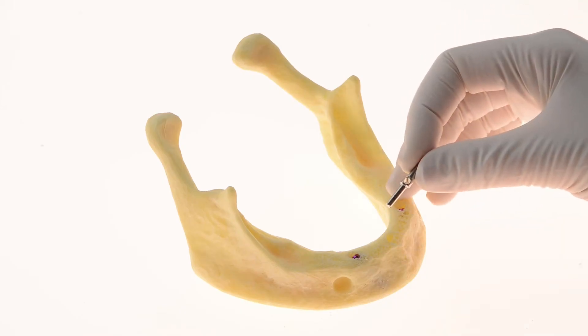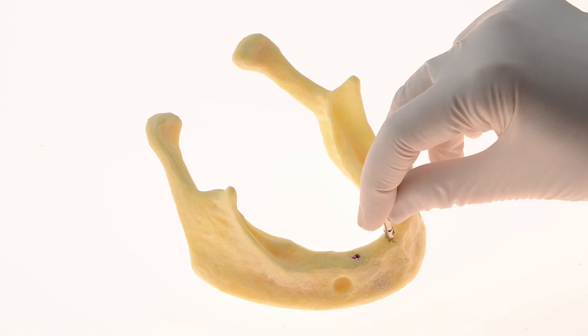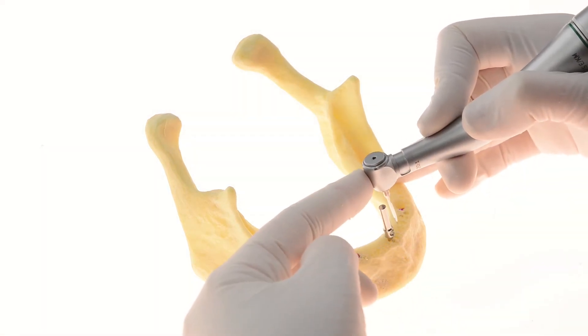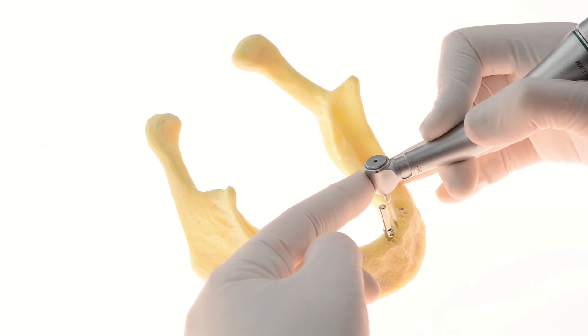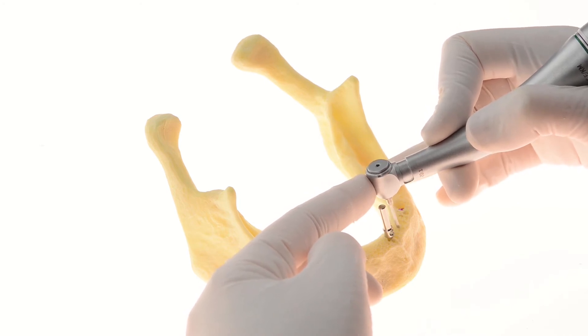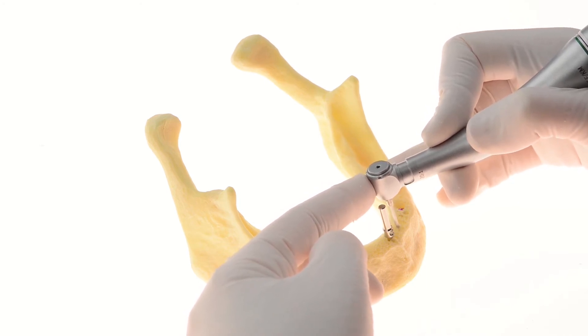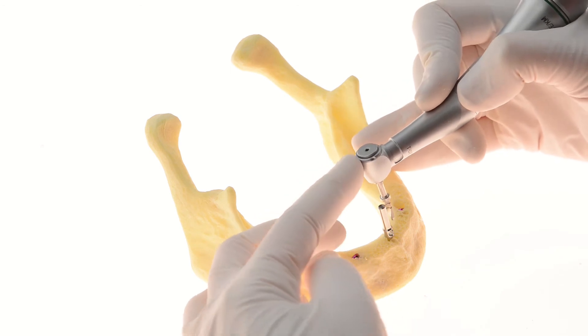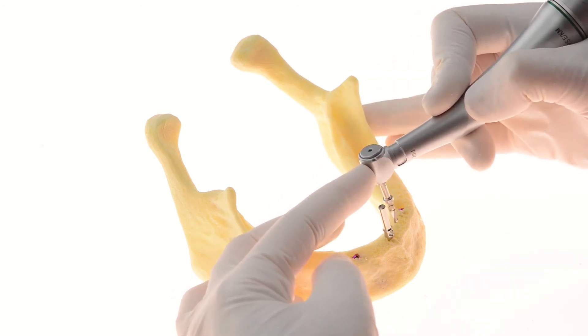A parallel pin may be used for orientation during the osteotomy preparation for the straight implants. The straight implants will be shorter than the tilted ones according to the specific case. At the end of this procedure, two tilted and two straight implants will be placed in the anterior area of the jaw.